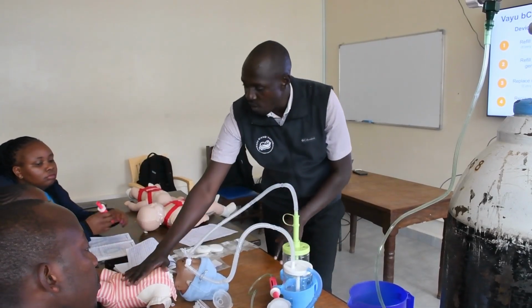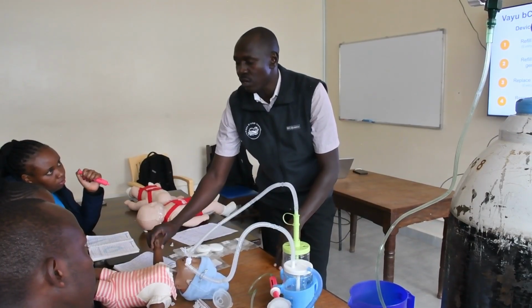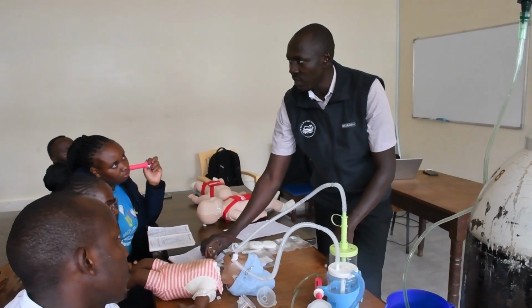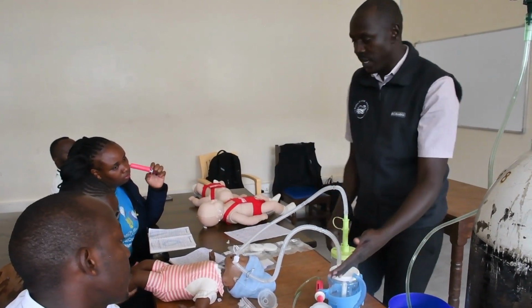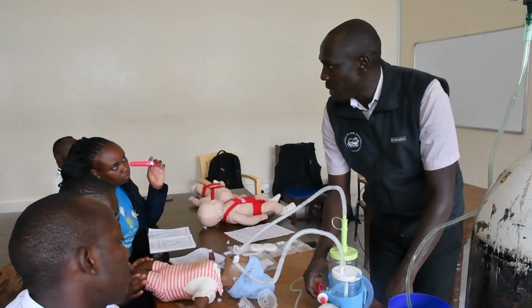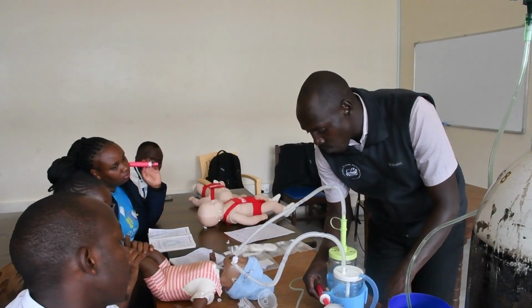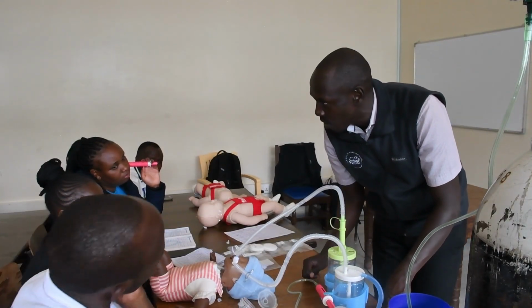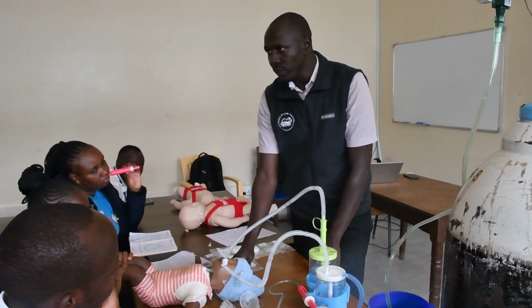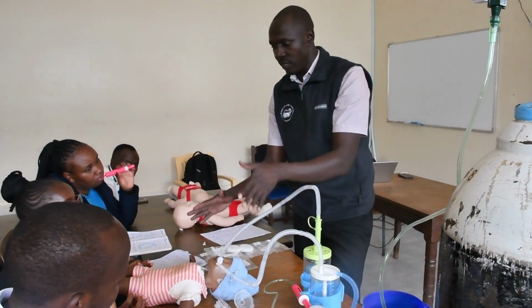Okay? So while checking breathing, then check your pulse, your oxygen saturations. Are your oxygen saturations above 90? If they are not above 90, what do you check again? You come and check if your FiO2 is appropriately set. If it is not at the appropriate FiO2, set your FiO2 again. And then continuously check the baby. So this is how you monitor the device and monitor the baby.